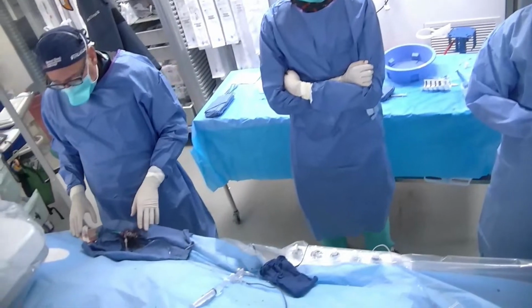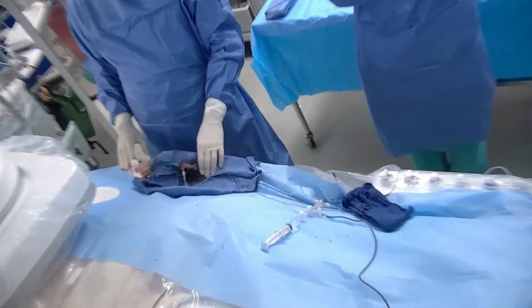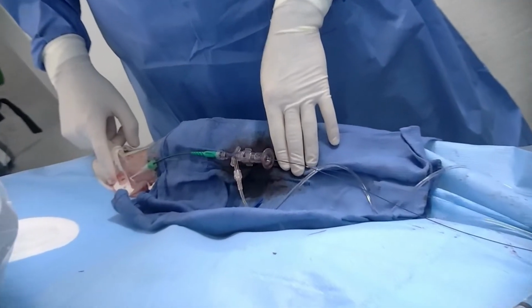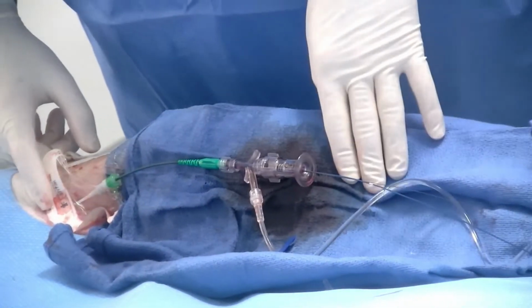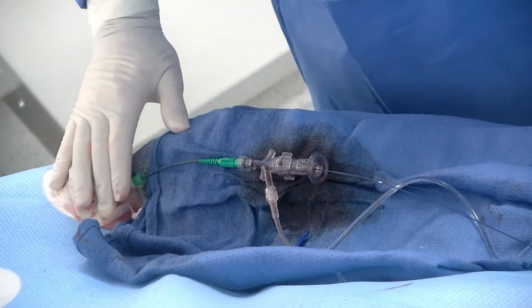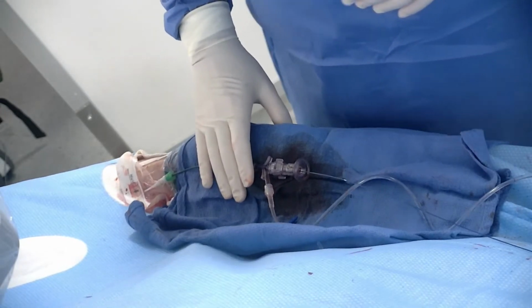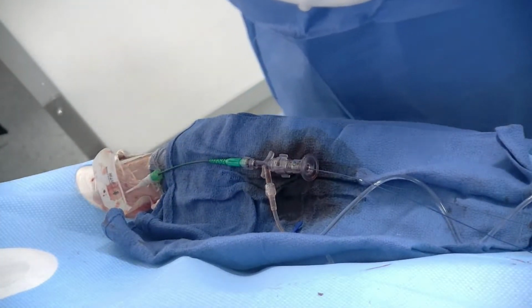But if you're able to show this, so what we sometimes do if patients are very, very tall, his actual fingers are right here where my left hand is, where I'm tapping, and you can see our access is probably a good 10 centimeters up his wrist. So we did not a true distal radial artery, I would say more of a mid to distal radial artery, just to give us an extra 10 centimeters, and that allowed us to place a 5/6 slender radial sheath here, and then we have a 6 French 100 centimeter FR4 guide cath, and we're planning on doing our interventions based on that.